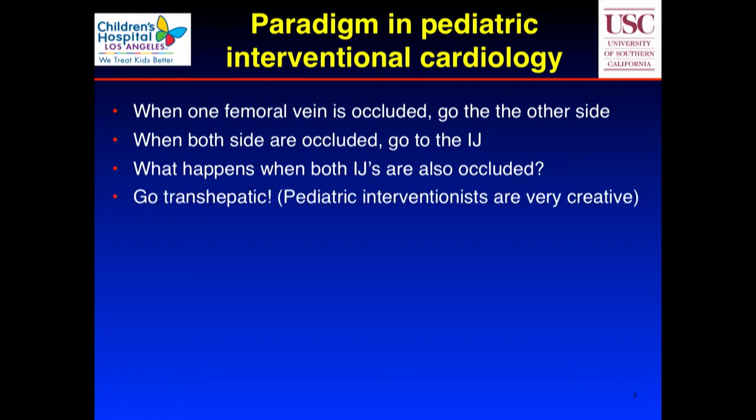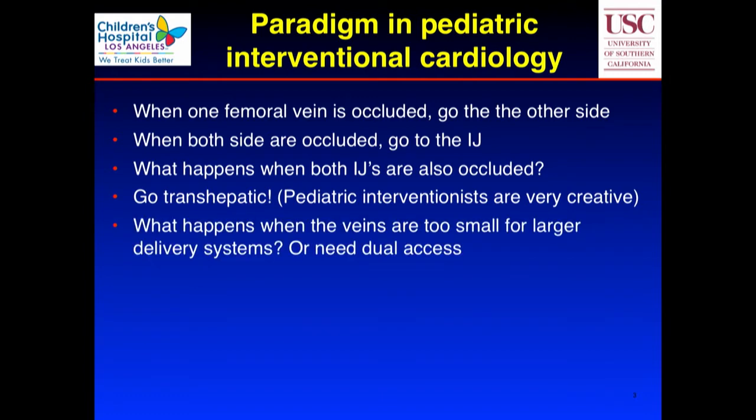You may go transhepatic, and we've done that too. We can't get to the heart, we'll stick a needle into the liver and go into the hepatic veins and go from there into the IVC and get into the heart that way. We can get very creative in getting access.